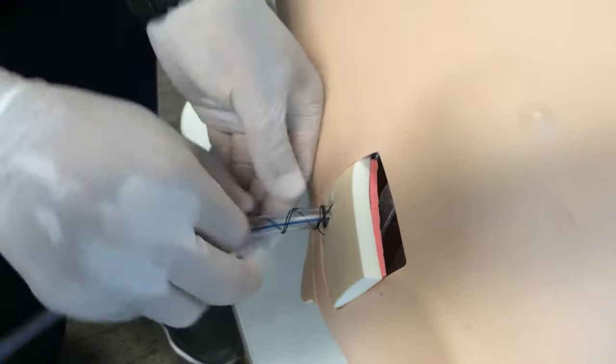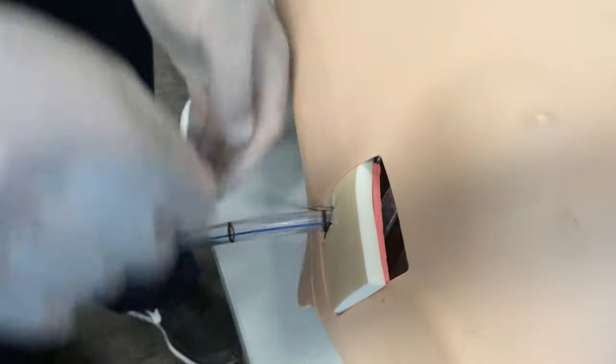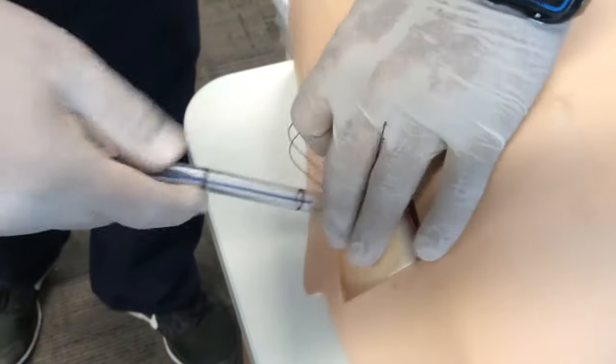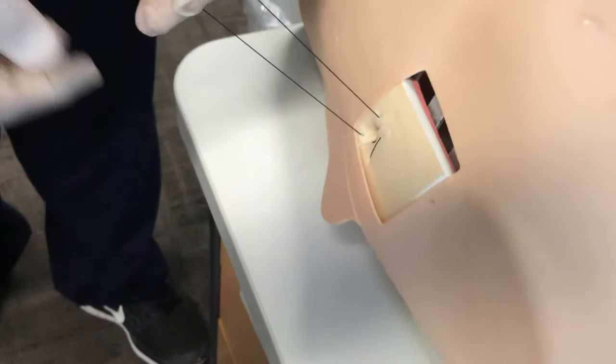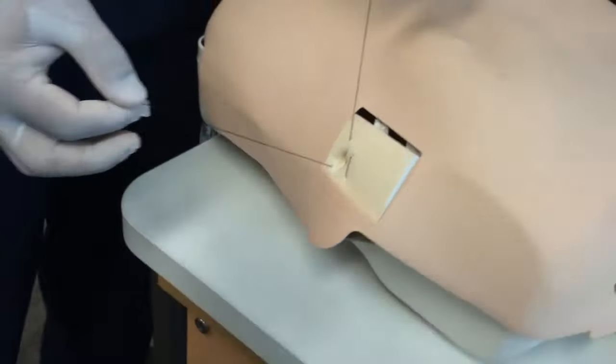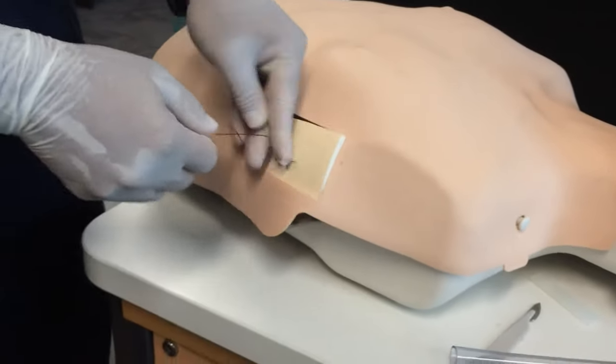So drain comes out. You've already cut the knot. That leaves you with the suture you originally placed in. Close the wound up.